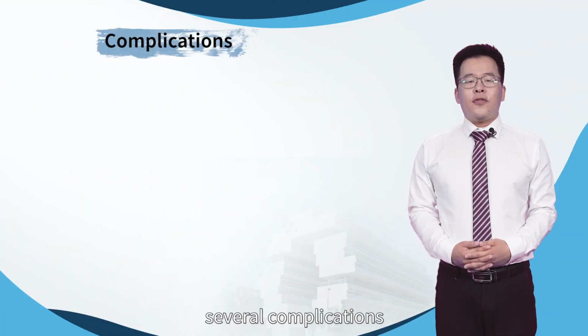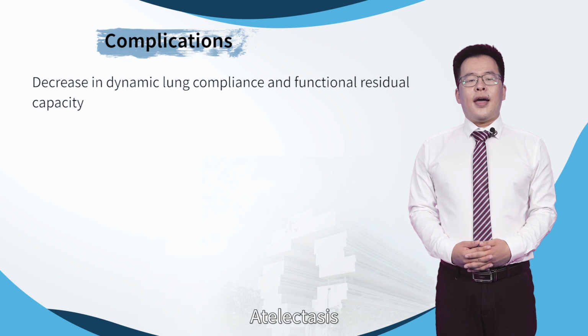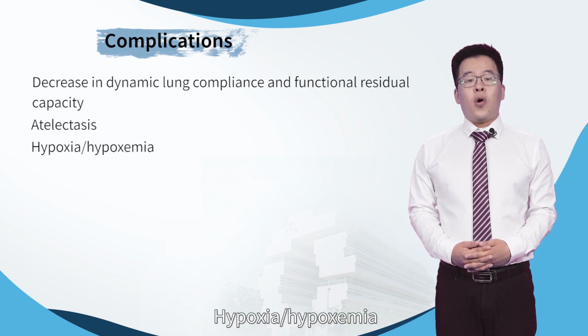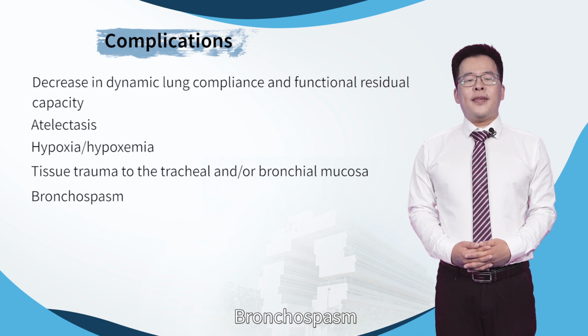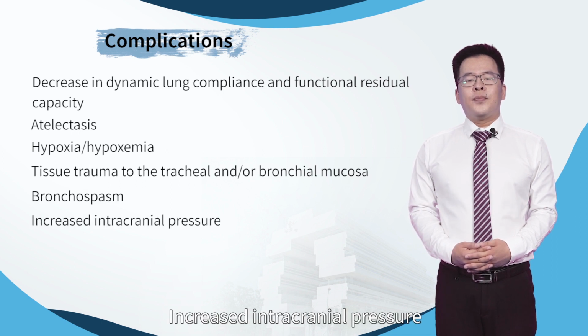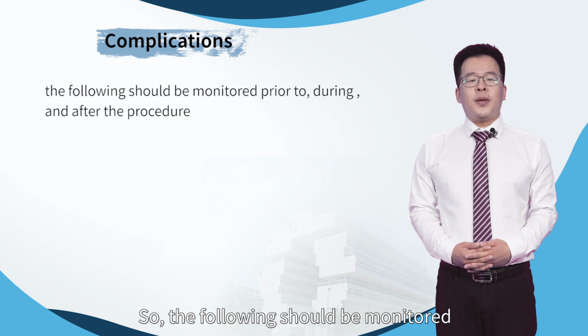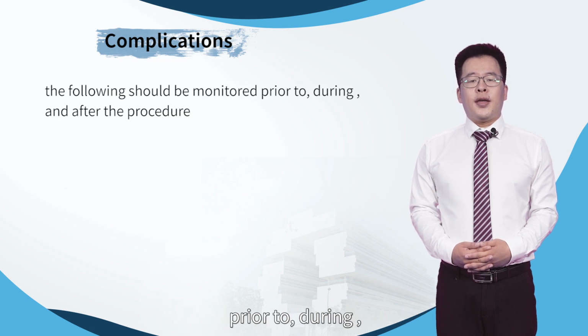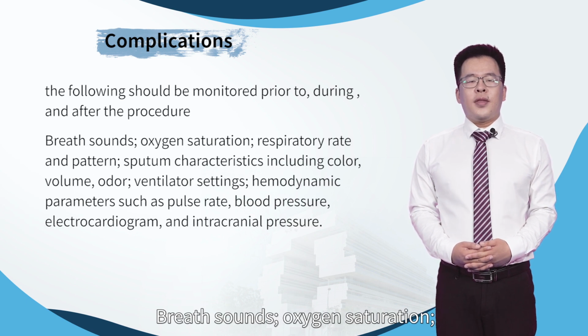Suctioning may cause several complications: decrease in dynamic lung compliance and functional residual capacity, atelectasis, hypoxia or hypoxemia, tissue trauma to the trachea and/or bronchial mucosa, bronchospasm, increased intracranial pressure, hyper or hypotension, cardiac dysrhythmias.